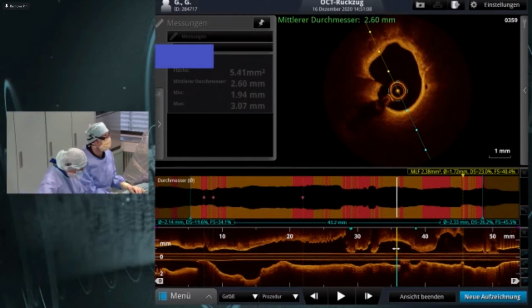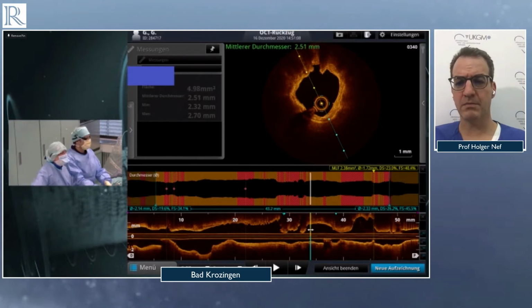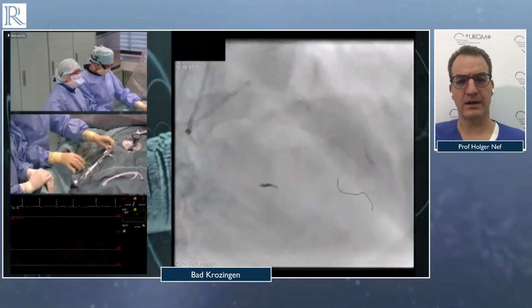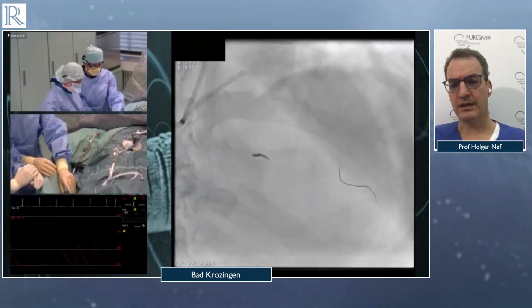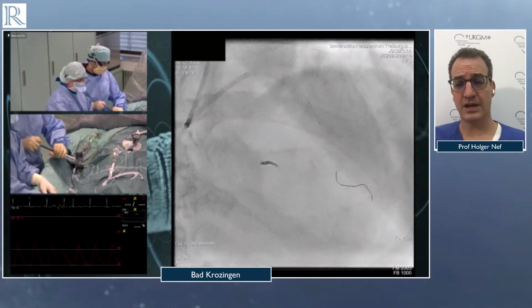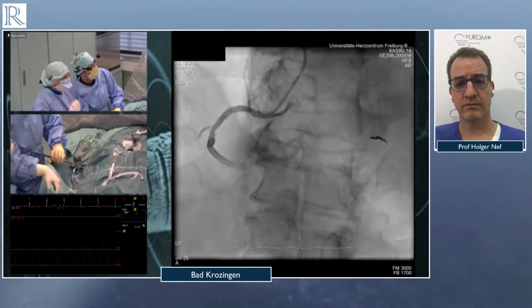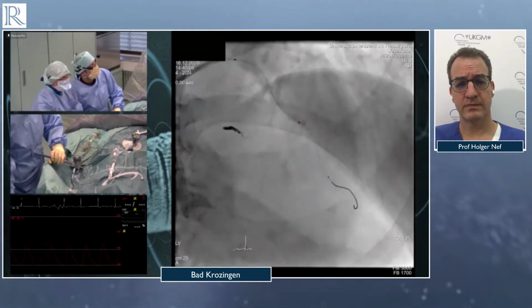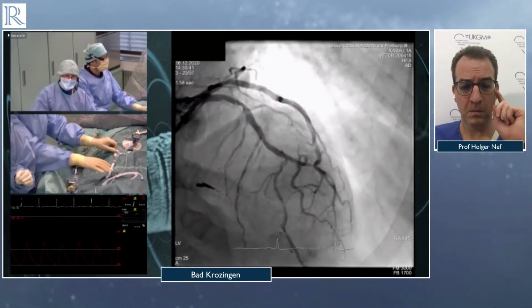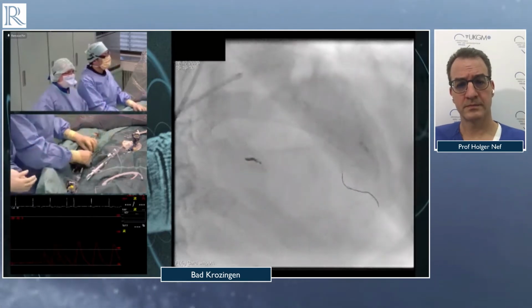Okay. So well, I can ask you to start with the case, because we run out of time, but just another question while you are bringing the catheter down there. Do you think that the lesion is very long, and which size of balloon will you choose? Holger, we can go direct with the placement of the IVL balloon catheter, but normally I would recommend, we now have very clear OCT data.